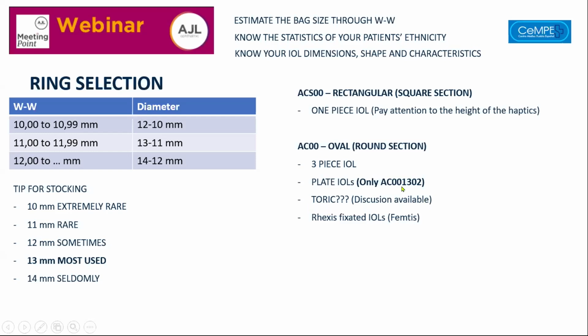if you implant them with a square section ring, you may experience slightly more incidence of rotation of the toric lens because the capsules are not fixing the lens immediately in the post-op, so it may rotate.